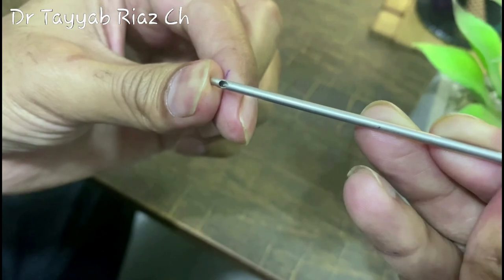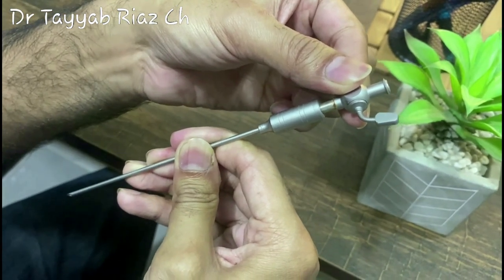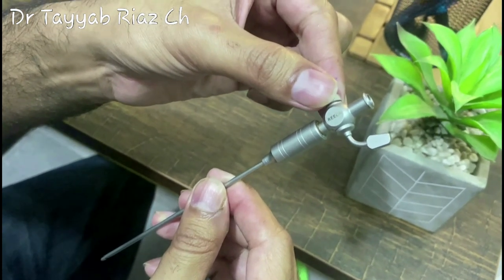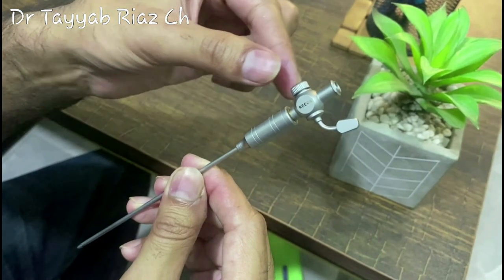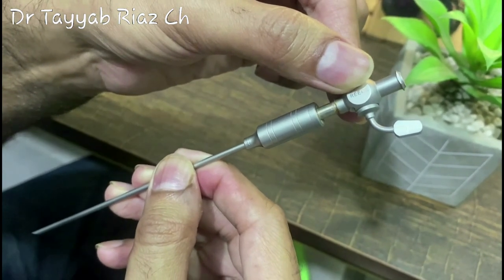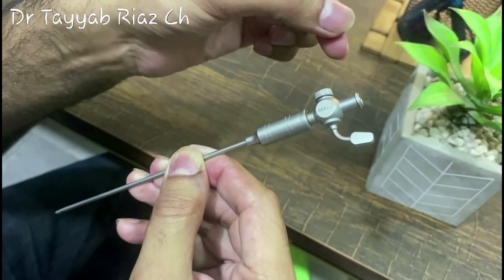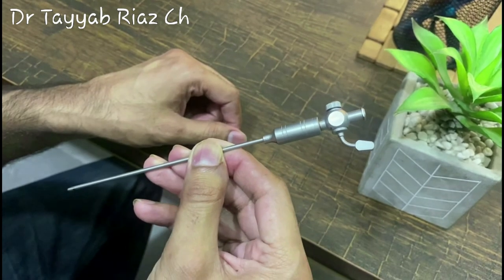Suppose my thumb is acting like a resistant structure, and when the needle comes across such a resistant structure, the inner stylet gets uplifted, and when the resistant structure is crossed, like the rectus sheath and the peritoneum, this spring comes back to its normal position. This spring mechanism is another way to know where your Veress needle is lying after insertion. For example, when you insert the Veress needle and this stylet is uplifted, it means you are against some resistant structure like the rectus sheath or the peritoneum. But when this spring gets released, it means you have crossed that resistant structure and now you are lying either in the preperitoneal space or in the peritoneal cavity.